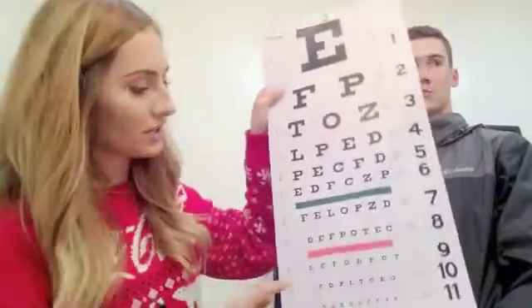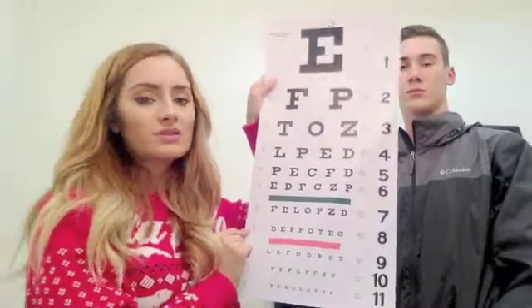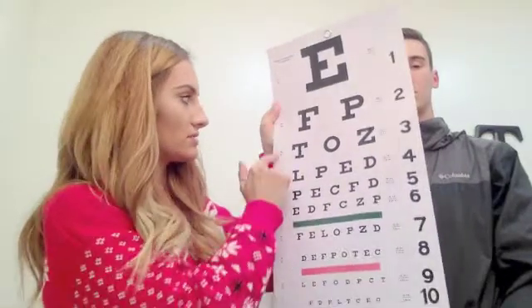Each line has a number next to it, and it says 20 feet, and then 20/20. So at 20 feet, this person would be able to read what normal people can see at 20 feet. As it changes, you can say at 20 feet, you can read what normal people see at 100 feet. And that will just change.